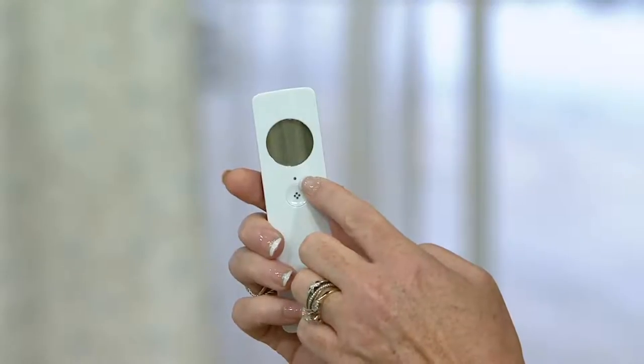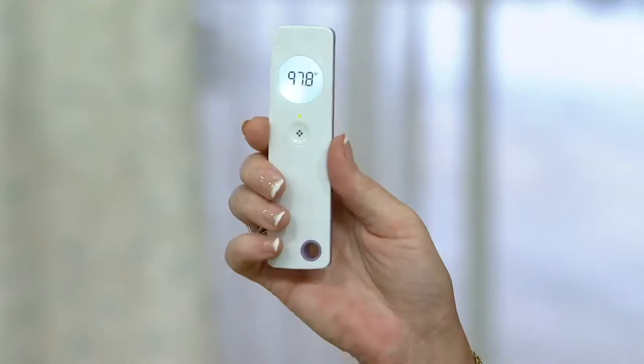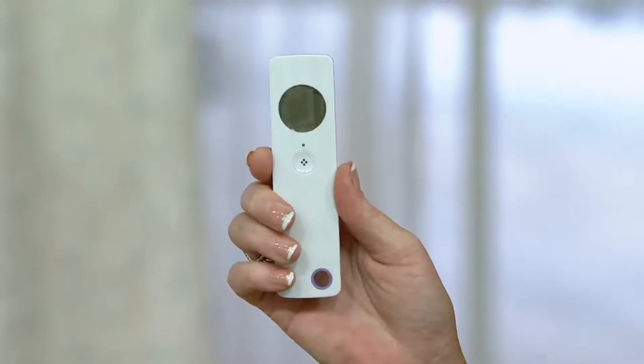I can read it without my glasses. There's a little indicator light right here — if your temperature is healthy, it will be green; if you're in the danger zone, it'll be orange; and if it's a high temperature reading, it will be red. And this was something I used when my little ones got sick last season.